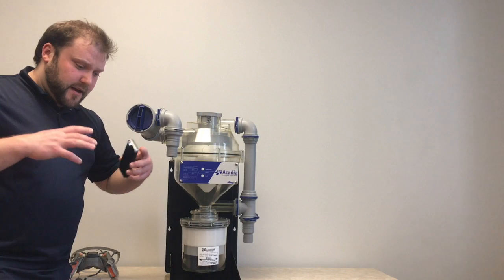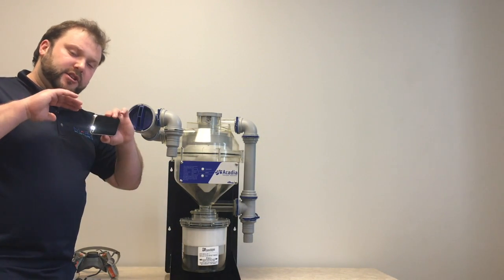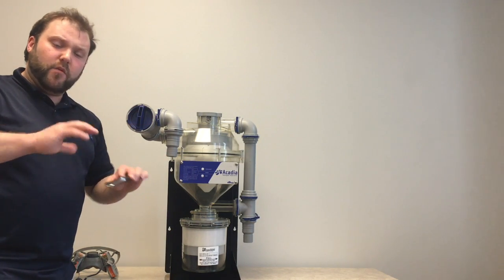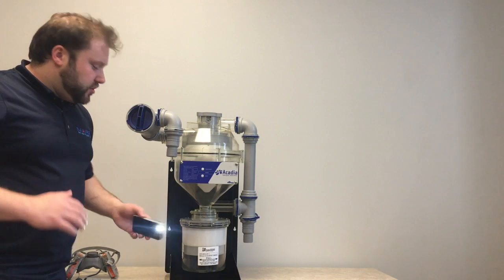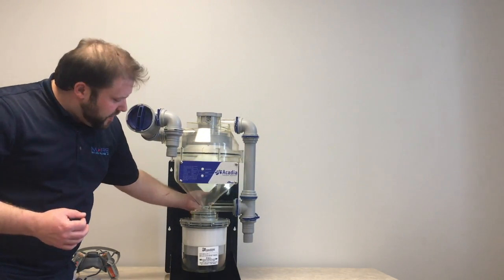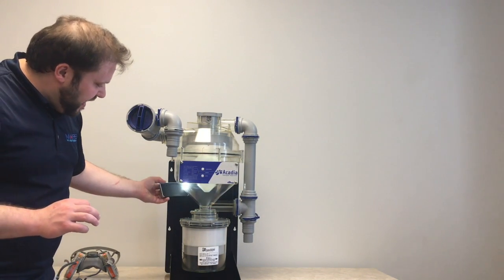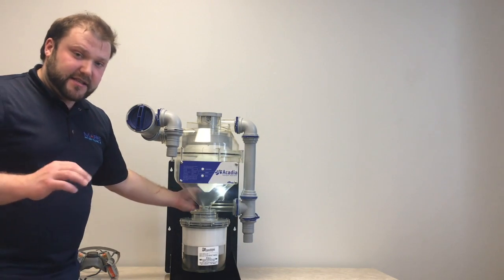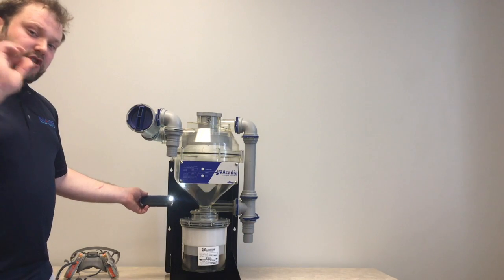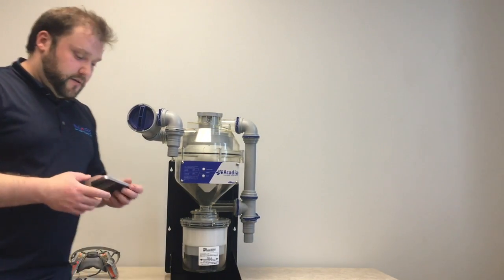Once again, I've mentioned this before, it's very hard to determine what is just amalgam sludge on the outer rim or on the outer walls and what is actual sludge buildup. So when you're searching, what you'll be looking for is consistency. If you can't see light consistently all the way around, you have sludge. If you see pockets of light shining through, then there's a chance it's just buildup on the outer wall.